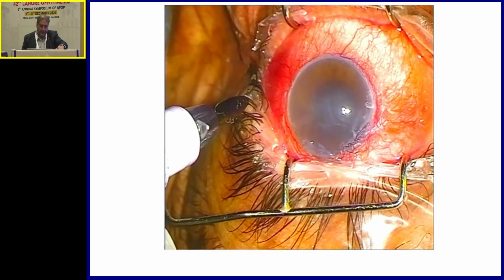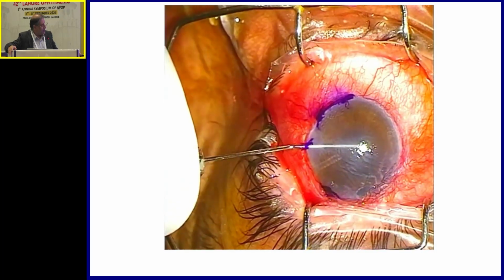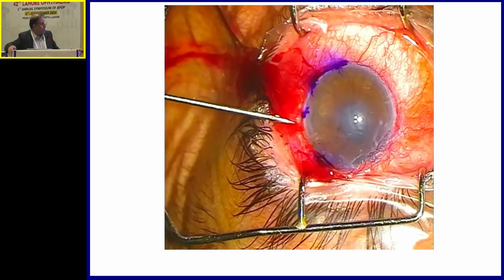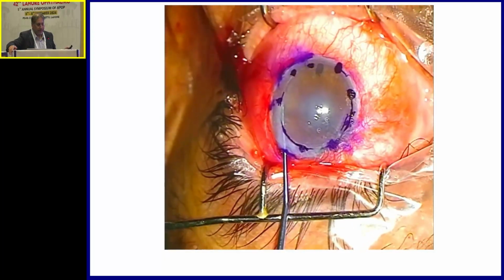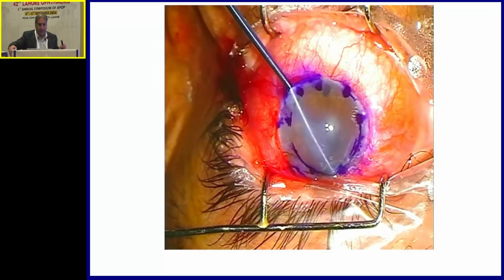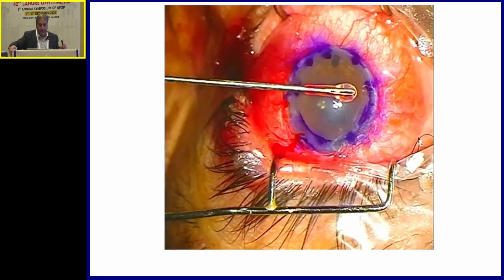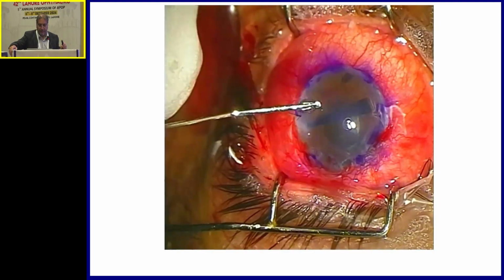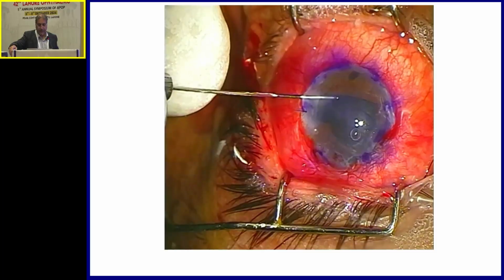This is the case where, you can see here, the tube in it, the valve is implanted. This is the miostat to constrict the pupil and to remove the PAS. Then I'm going to cut this long tube to make it smaller, so that it should not come in the way of my graft. Look at this. So this is the inferior iridectomy I'm doing. This is the unfolding of the graft.